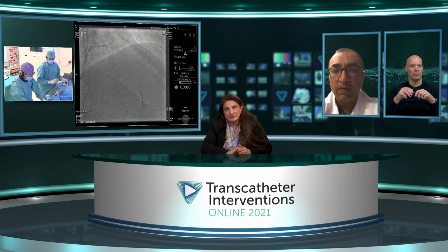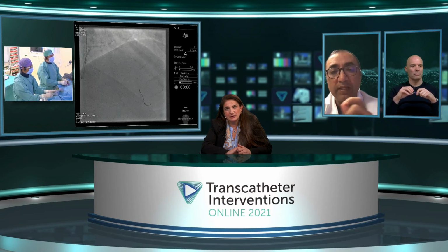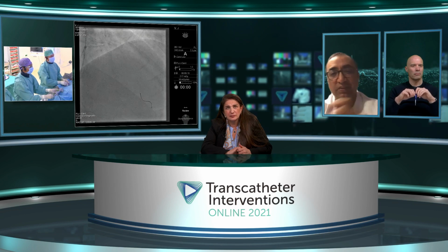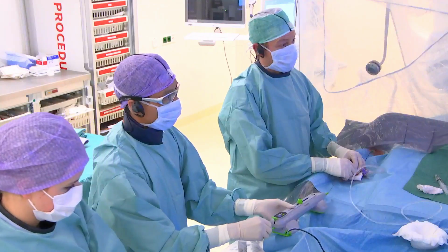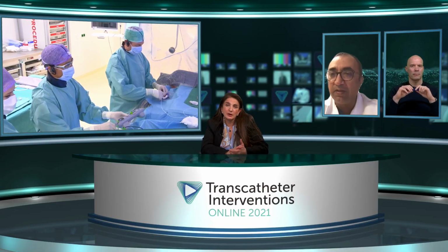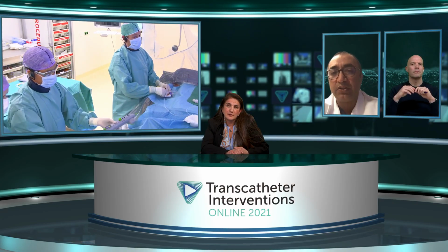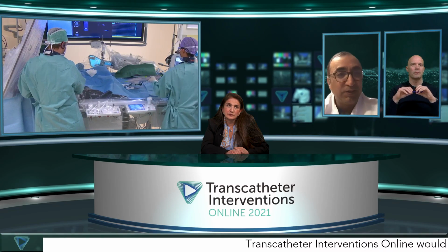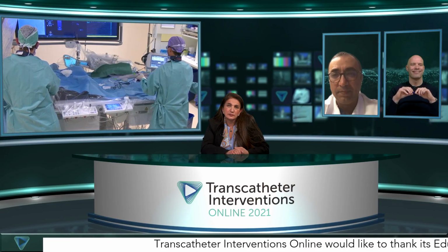Right. So let's have a look. I did think the imaging showed very nicely the technique is different to rotational. You know, in rotational, we just would burr all the way down. He burred the one lesion, you then came back, you then sanded the other lesion. You didn't touch the area in the middle where there's no calcium and you could potentially cause a dissection or injury if you touch the area in the middle. So it was a really good technique. Considering you've only been doing this for 2 months, Joost, nicely done.